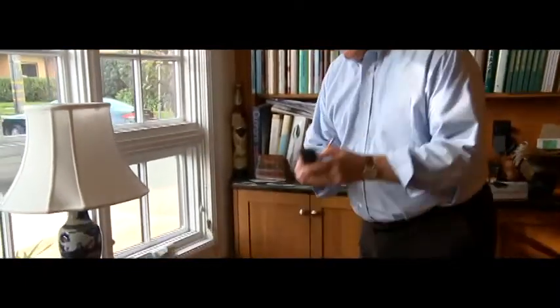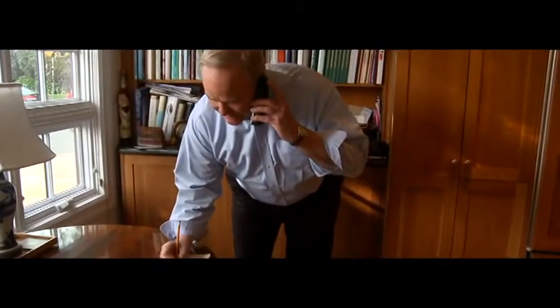With these newer IOL designs, people may enjoy the convenience of being able to see better when they're not wearing eyeglasses or contact lenses. However, it's important to understand that these newer IOLs should reduce, but will not necessarily eliminate the need for glasses. I found that I can see or read actually without the glasses up close, but it's not quite as clear. You know, if someone were to call me and I didn't have my glasses and I needed to write down a telephone number, I could do it. In a situation where I just don't have my glasses, I can get along just fine.